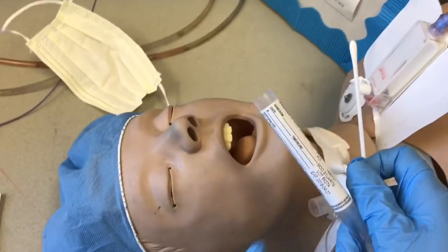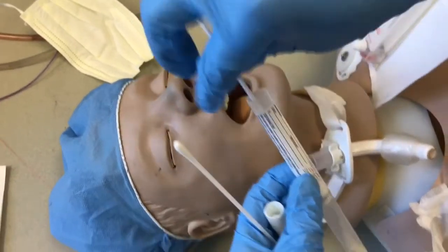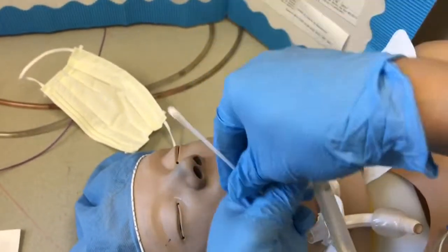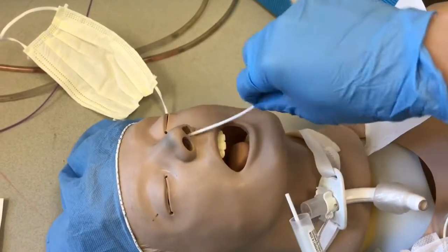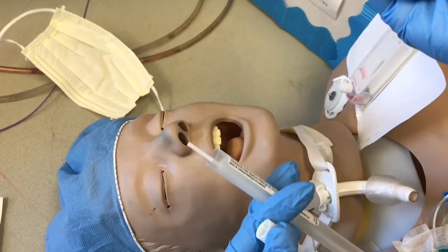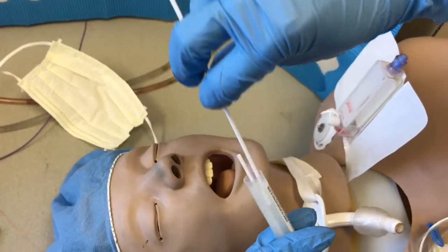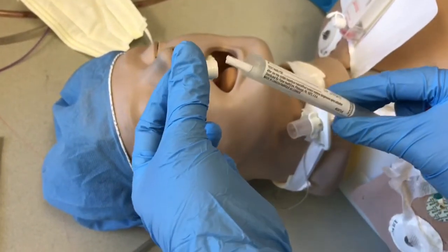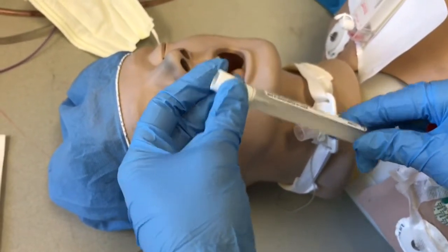Tell the patient you're going to go in. Go all the way towards the back of the nose, swab it in, and then place it inside the container. If your facility does two swabs, get it out, move to the other nostril, go all the way to the back, and swab. There shouldn't be any discomfort for the patient — it's pretty simple.